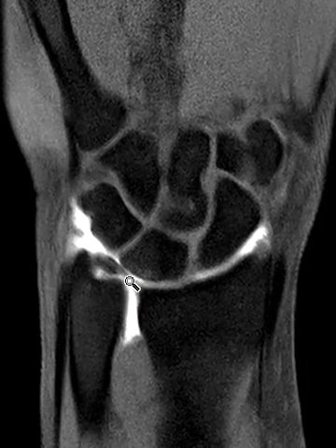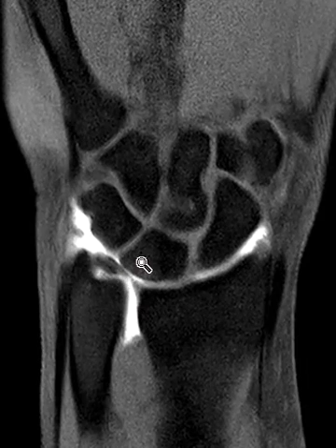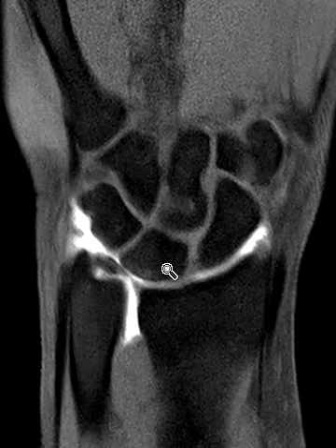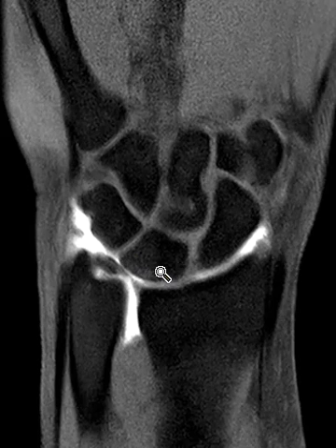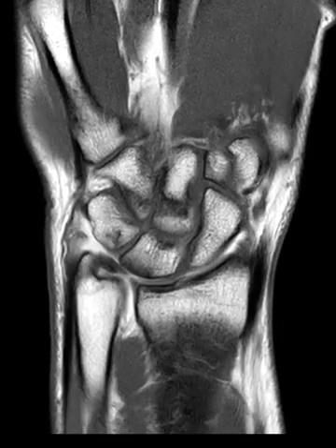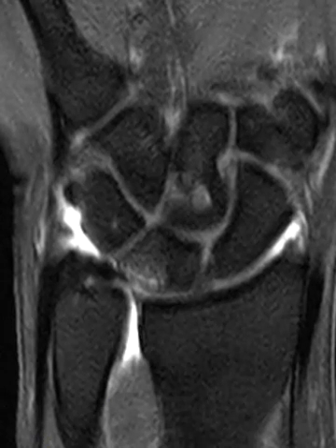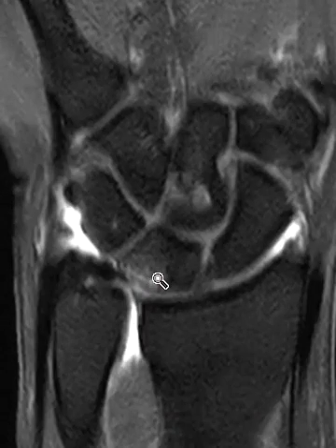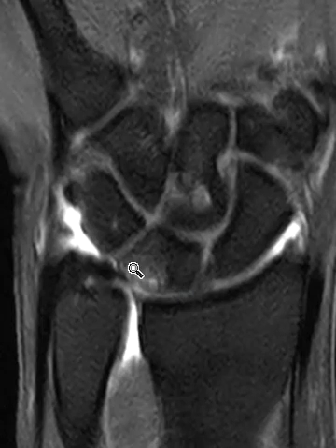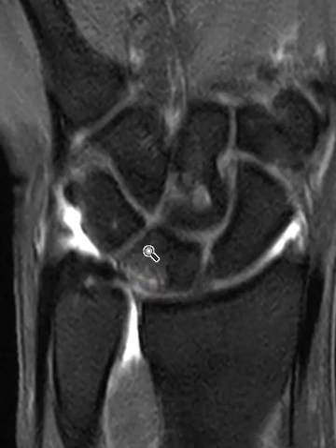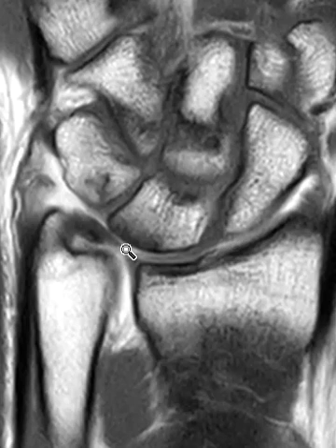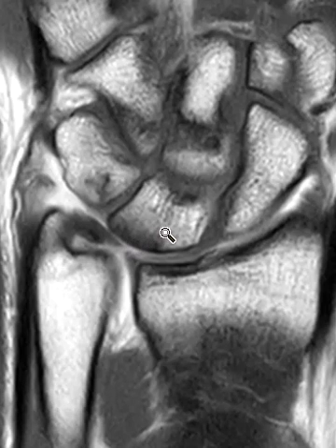That's exactly what we have here — a full thickness tear right there, and the ulna abutting. This is called ulnar abutment syndrome, and you typically will see some marrow changes within the proximal lunate bone. You can't see them very well on the T1 weighted fat-suppressed sequence, but on the other sequence we see dark signal on the T1 images — this is edema and/or sclerosis of the bone. You can see there's subchondral marrow edema in the base of the lunate bone. So this is a case of ulnar abutment syndrome with reactive marrow signal changes at the base of the lunate, and that small full thickness tear of the central disc of the TFCC — a bread and butter case. Thank you very much.